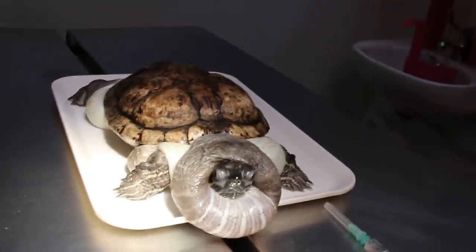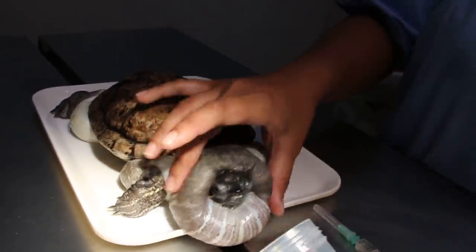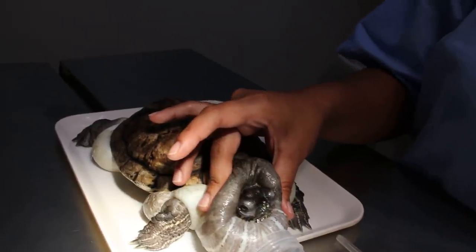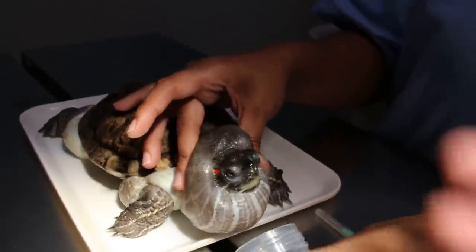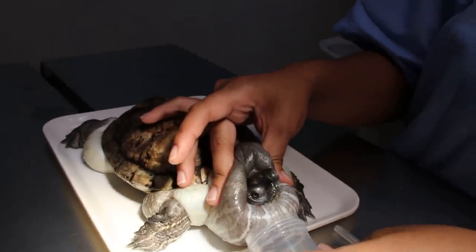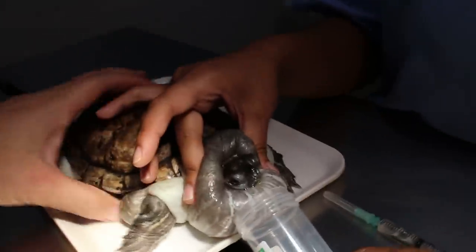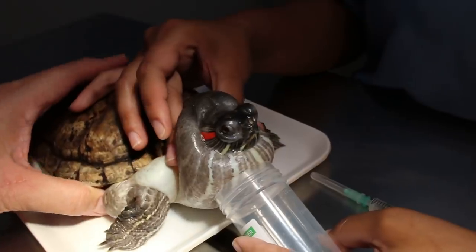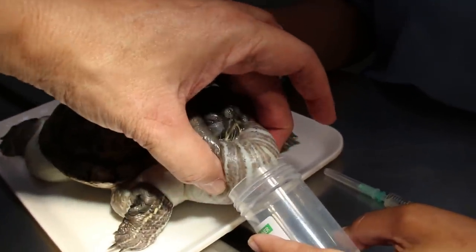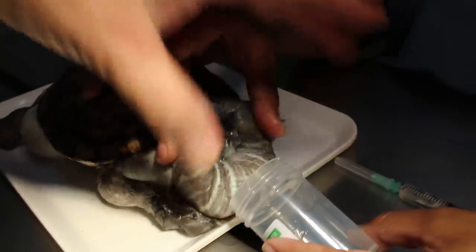Quick — collect the fluid so you can send it to the lab. Up a bit. There should be more, they're coming out. Yeah, express the fluid there.